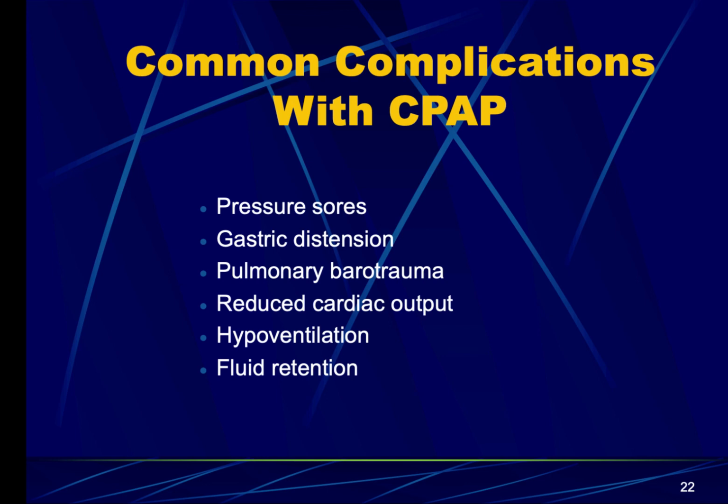So make sure that you guys are watching the videos on this, right? Specifically on how to set up the neb setup with the CPAP machine. It's actually quite easy. I think it's a great video for you guys. And again, remember, these videos are available to you throughout the whole semester. You need to be watching these videos multiple times, specifically the breath sounds audio files that I've put up for you. You really need to start looking at those lung sounds, okay? Start listening to those lung sounds in order to help you when it comes to scenario practice.